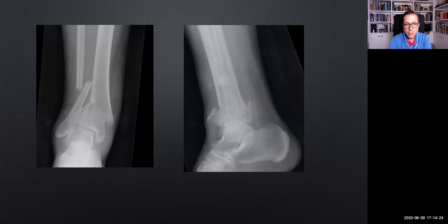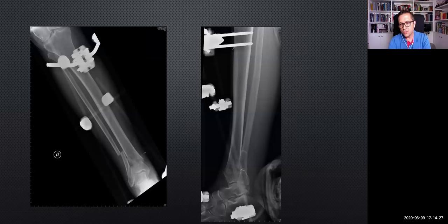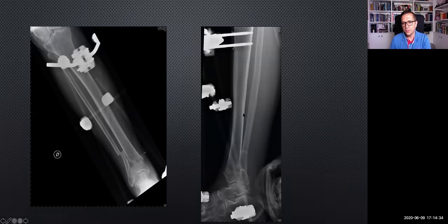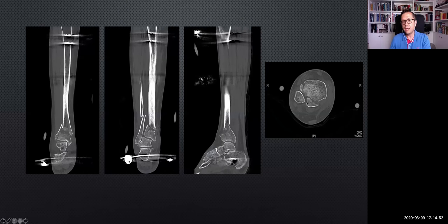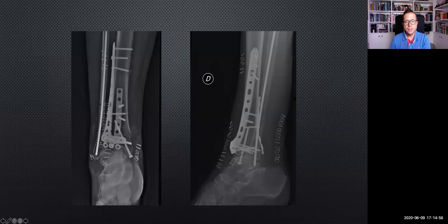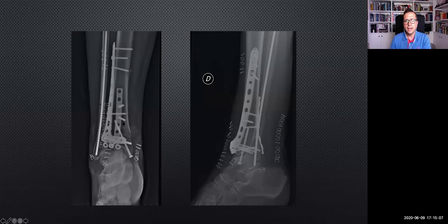Another high-energy comminuted type C fracture — we followed the staged procedure. The pins in the tibia are placed far away from the definitive location of the tibial plate. Also, a pin in the calcaneus and a pin in the first metatarsal bone. CT scan after ex-fix to see the fracture pattern and plan the definitive fixation. The final result shows a type C fibula with intramedullary fixation — anterolateral plate, posterior plate, and one screw — with a good result.